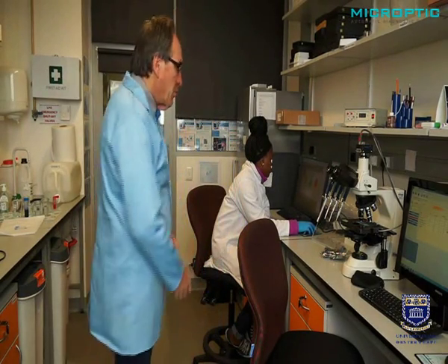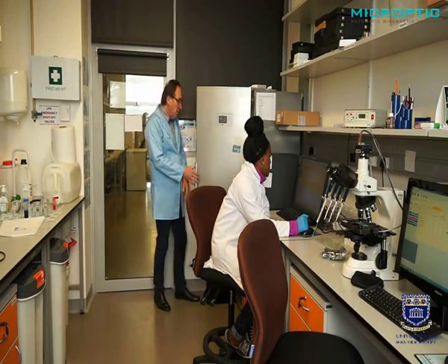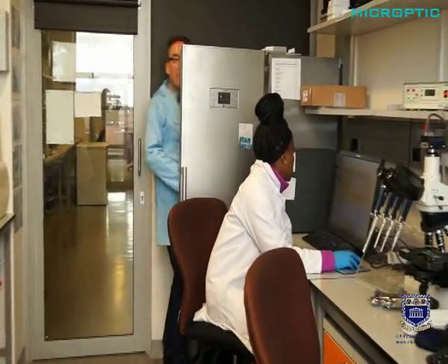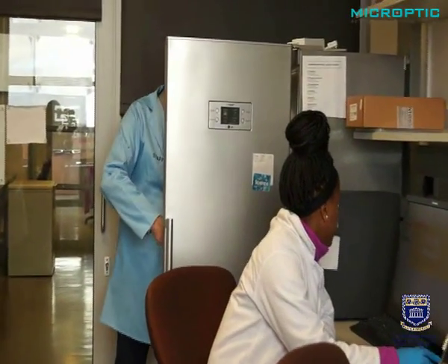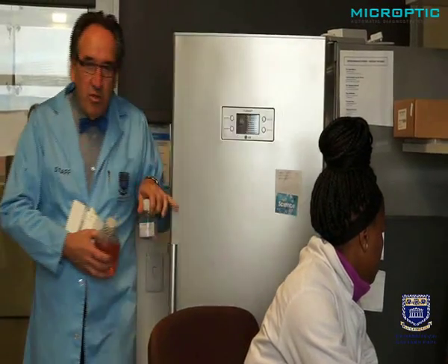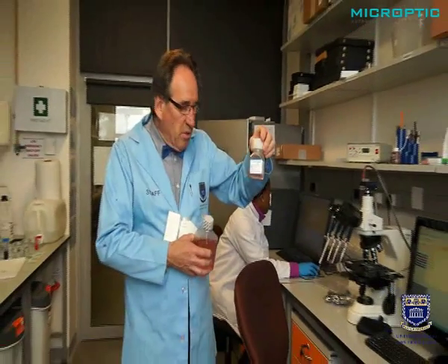Yes, what else is important? We spoke a lot about temperature control, but what about media? Yes, you need to warm up your media also long before the time, but you must take a lot of precaution to keep your media in a good, well temperature controlled refrigerator, and I will show you some of the more important media that we use. In this instance, I am going to show you a kind of general sperm wash that we use.